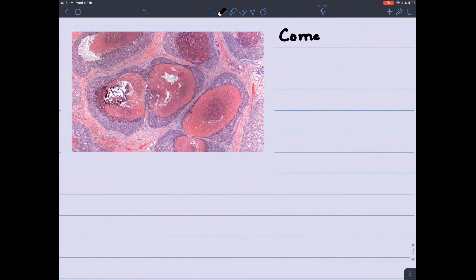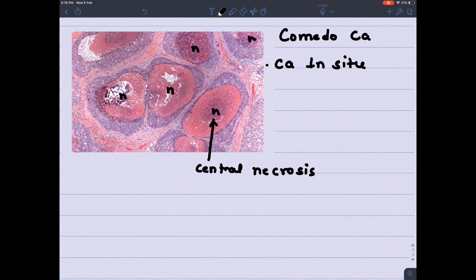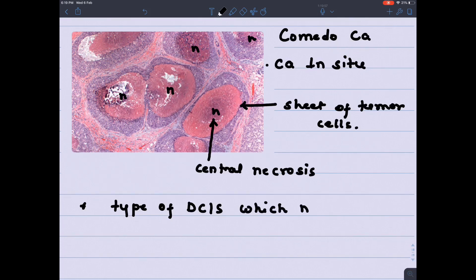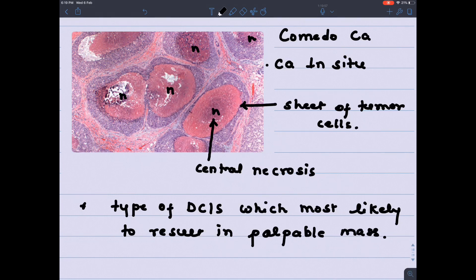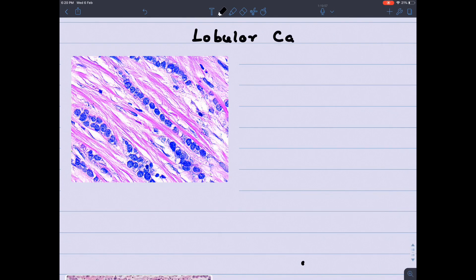Comedocarcinoma is a very important topic and commonly appears in MCQs. It is a carcinoma in situ. Looking at the image, you will find a central dark-pink necrotic area surrounded by a light blue zone, which is a sheet of tumor cells. Central necrosis surrounded by tumor cells is the comedo pattern — that is why it is known as comedocarcinoma. It is a type of ductal carcinoma in situ (DCIS) and is the only DCIS most likely to present with a palpable mass.